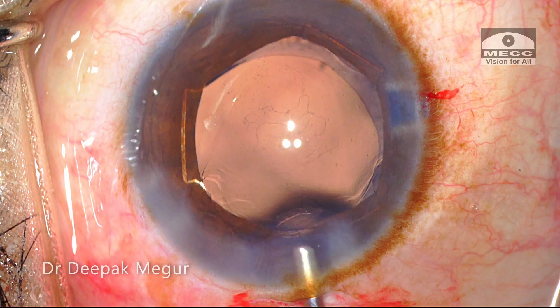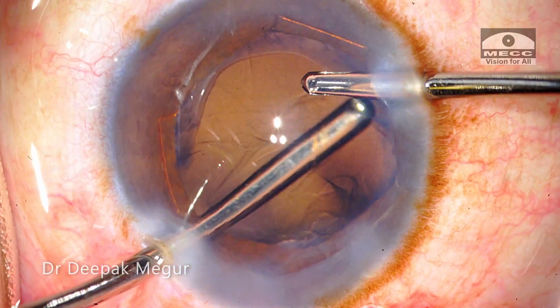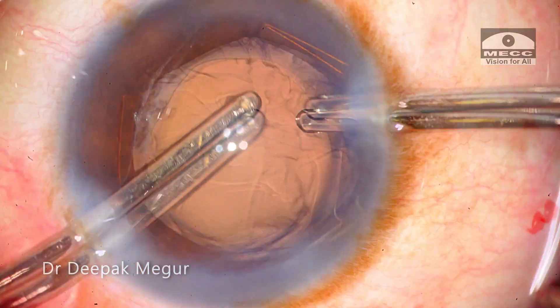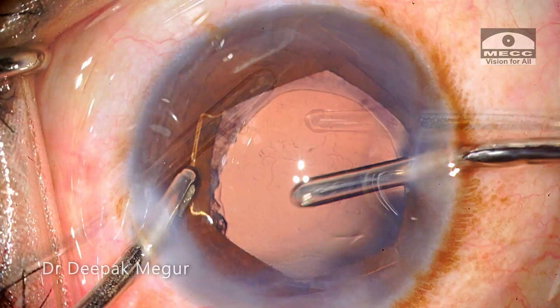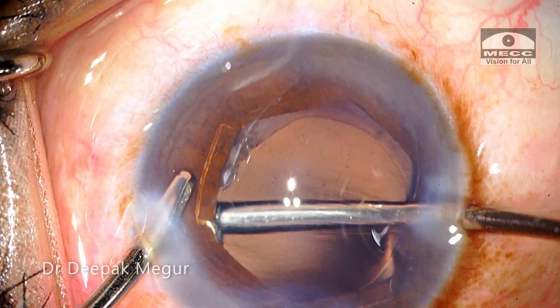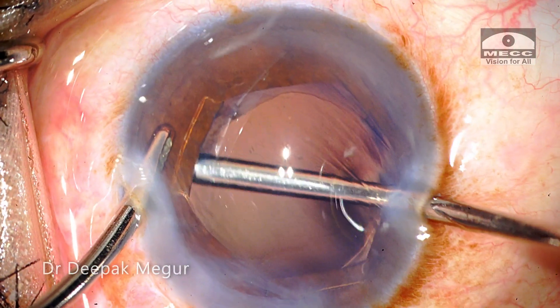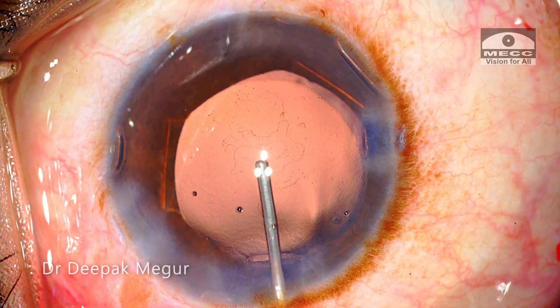The bag is filled with viscoelastic and cortex aspiration is being done. Rarely, we may have fluid misdirection in eyes with extended rhexis, causing shallowing of the anterior chamber because fluid gets across the zone of discontinuity into the vitreous space and pushes the entire bag forward. But luckily in this case, nothing like that happened — the chamber and the bag are nice and deep, and cortex aspiration is completed.